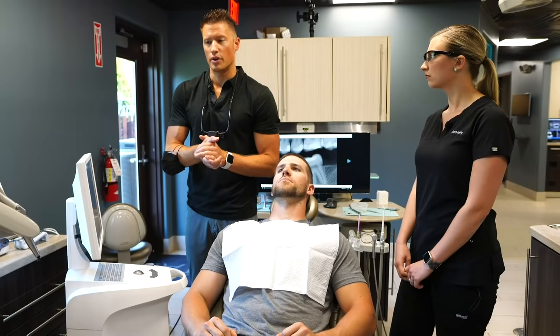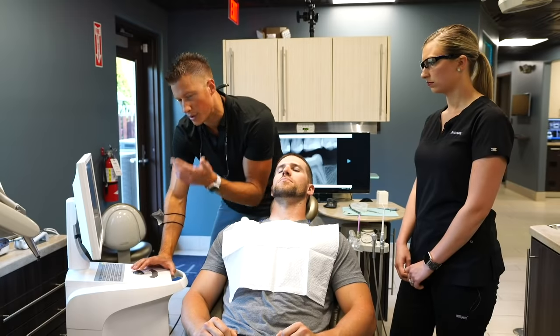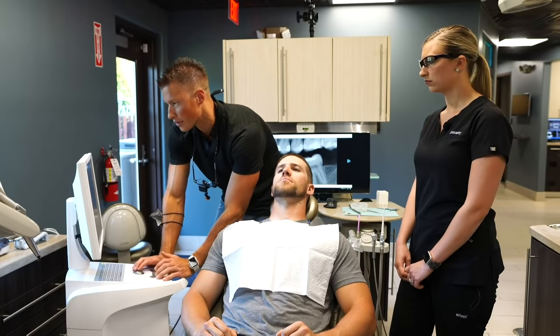And to that note, bone grafts are seldom necessary when an extraction is performed carefully and the roots are extracted without much trauma to the surrounding bone. Now, sometimes you just can't avoid that, but if you're super careful and don't mess with the bone around it, and we have all of the walls of the existing bone still present, then we don't have to graft and wait that amount of time. So grafting does add time, but most times we don't need grafting. So I thought I'd throw that out there.